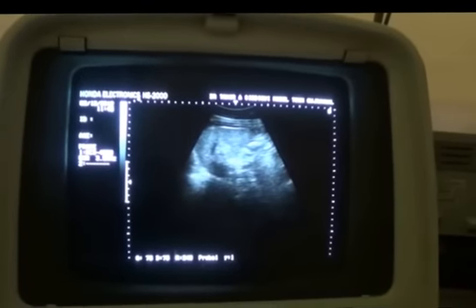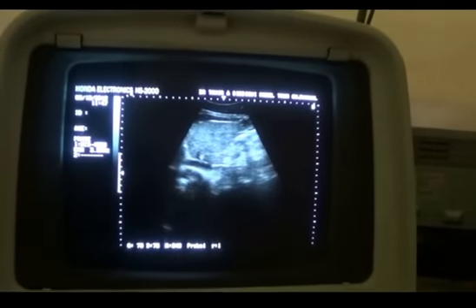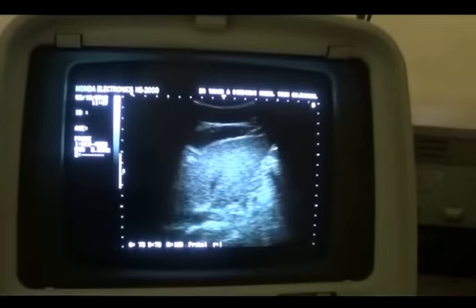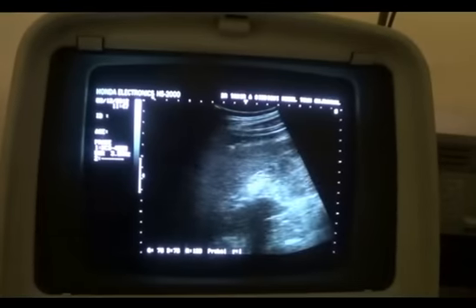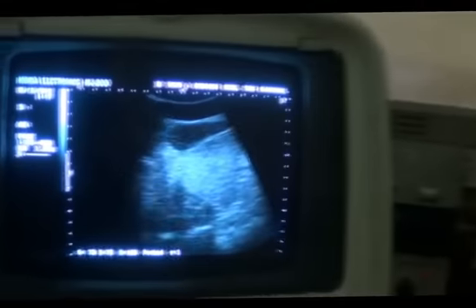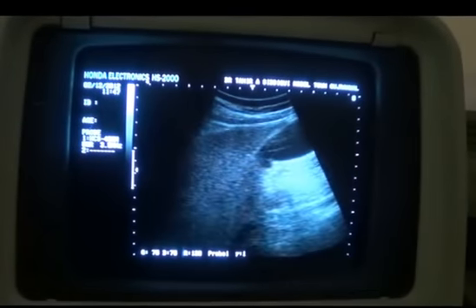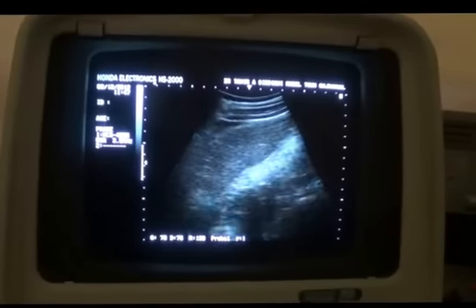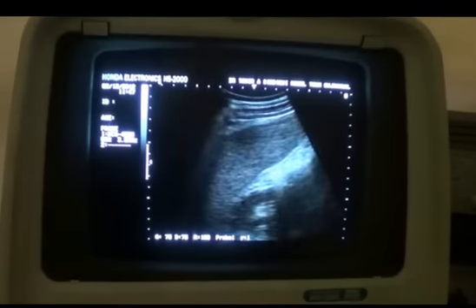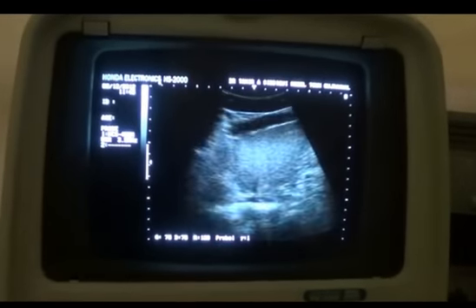This is segment 5 regarding the evaluation of liver span by real-mode ultrasound. This is a liver seen below the costal margin when I give a sweep to the probe below the costal margin. I place the probe and give a sweep down to the lower costal margin from here to here, and I can clearly see liver below the costal margin. This is how I am giving a sweep to the probe — and I see the liver below the costal margin, suggesting that the liver is enlarged.